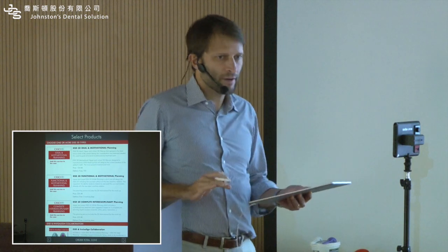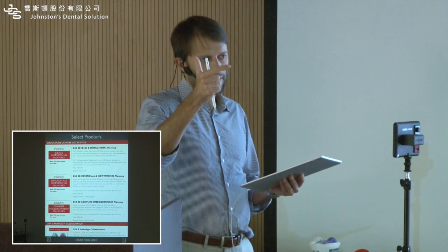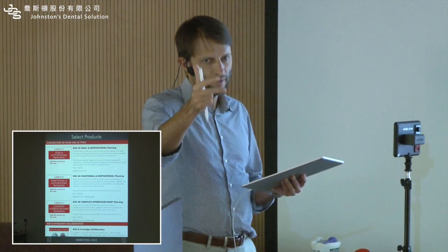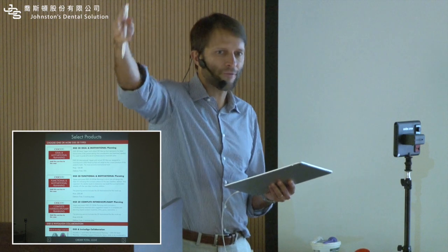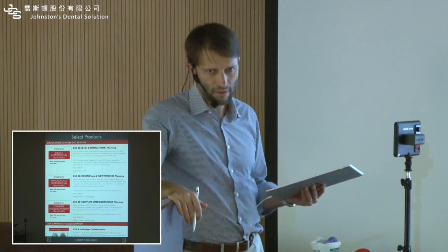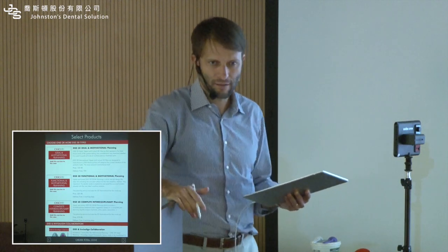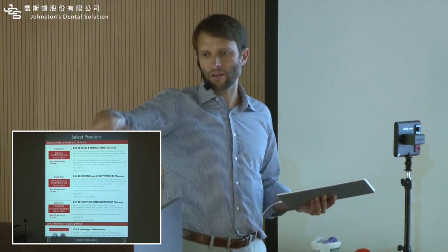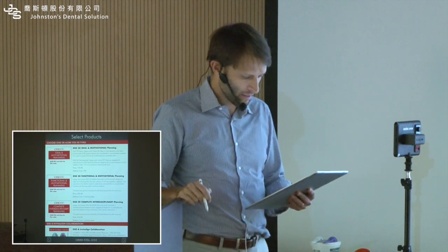Usually only with the upper is enough for you to plan, make the mock-up, sell the case. And then whatever is needed after case acceptance, you order afterwards. So you don't need to take the risk of investing on something before the patient says yes. Because we don't know. In 3 days he's going to come back. We don't know. So the minimum package is the top one. Okay, the top.